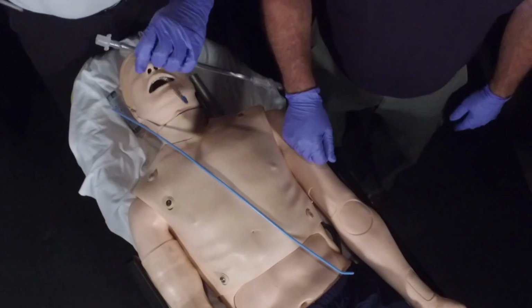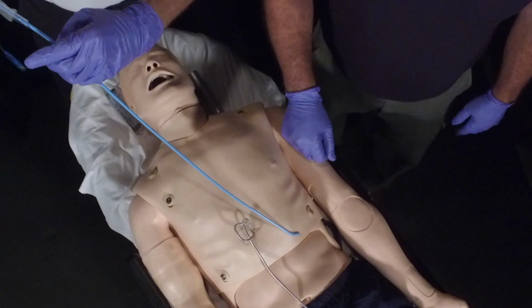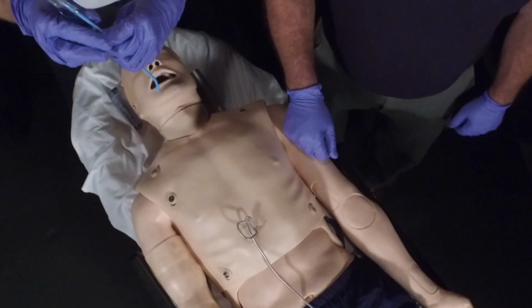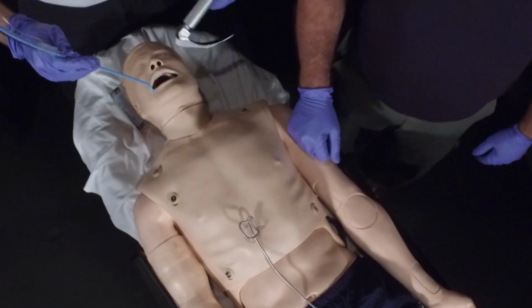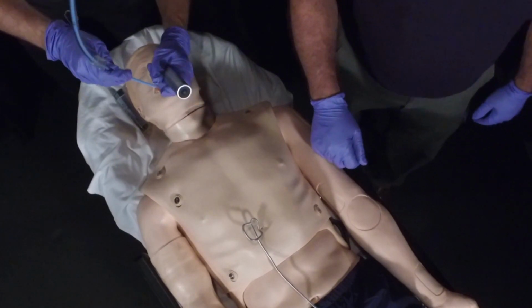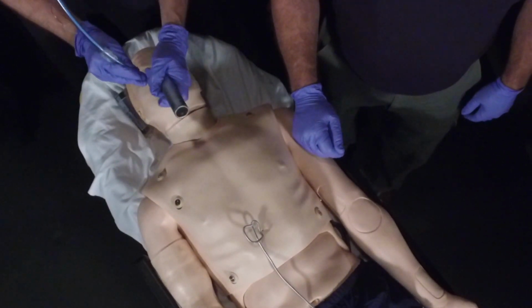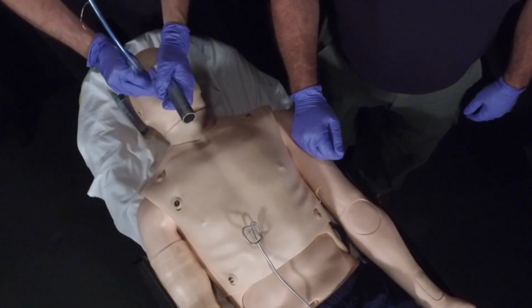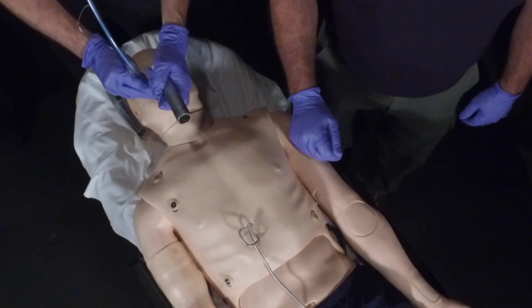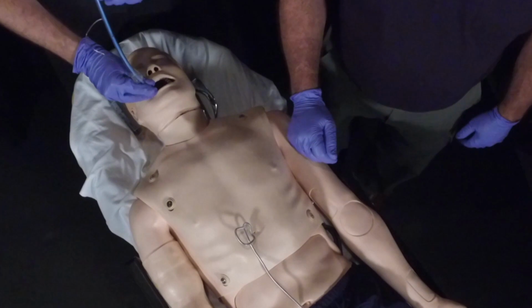We're then going to use our laryngoscope like we normally would, find the base of the tongue, attempt to find the epiglottis, lift the epiglottis as best we can, but understanding the anatomy, we would take the soft Bougie stylet, slide it under the epiglottis to where the trachea should be, and as we slide it into the trachea, we're able to feel the tracheal rings with that curved end. So we feel this device actually clicking on the tracheal rings.